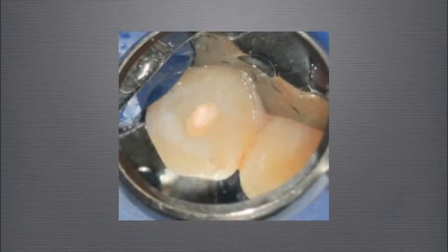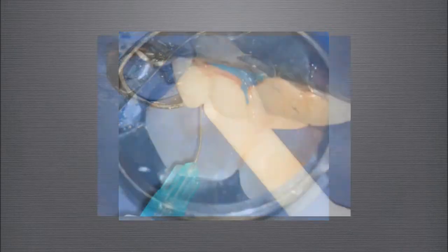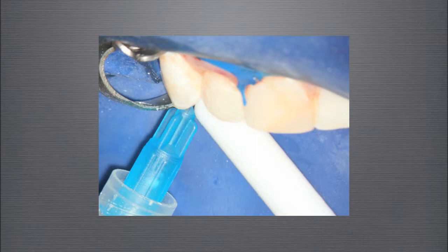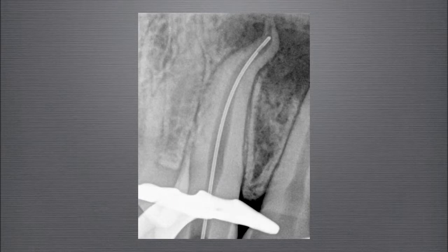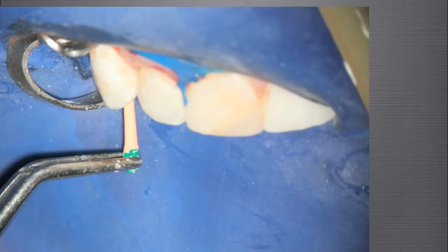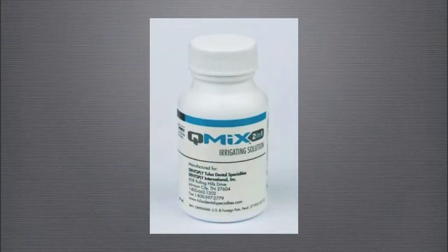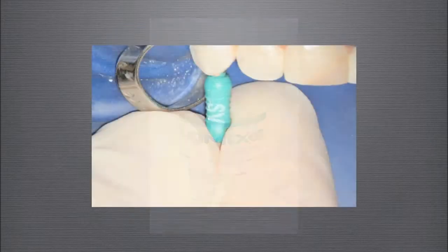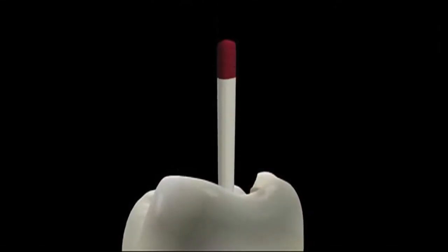After completing my access, it was apparent that the canal already possessed the shape necessary for proper irrigation and obturation. Utilizing the Tulsa Pro-Rinse needle, sodium hypochlorite was delivered to within 1 millimeter of the confirmed working length. Note the position of the Pro-Rinse needle in this radiograph. Agitation of the irrigant was performed by pumping a gutta-percha point in an apical-coronal manner — note the curve imparted on the point. QMix was utilized as the final irrigant, and a number 35 size verifier was used to confirm adequate shape for the GuttaCore carrier.